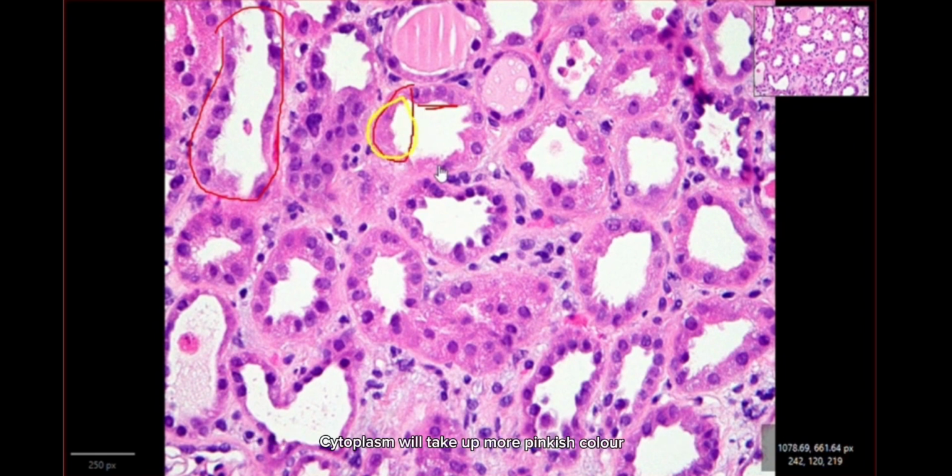The cytoplasm will take up more pinkish color and the nuclei fade, they become pyknotic, like shrunk, dot-like structures, and sometimes the nucleus gets a very dark color. So you can appreciate the fading of the nuclei here and a lot of eosinophilia in the cytoplasm. These are some of the patches of necrotic tubules that you can appreciate in the kidney architecture. Again, this is a coagulative type of necrosis because you can see that the overall architecture is preserved.